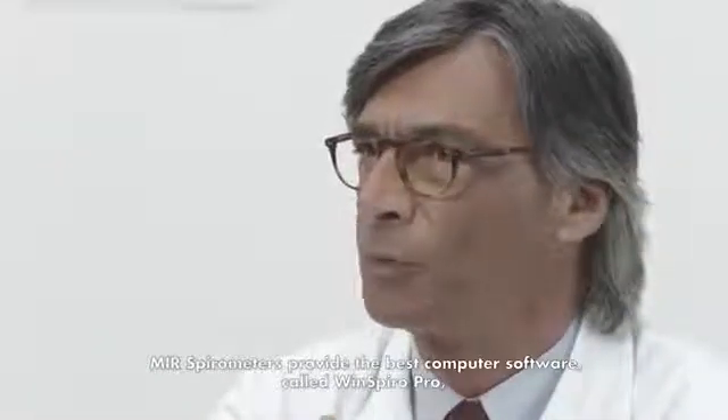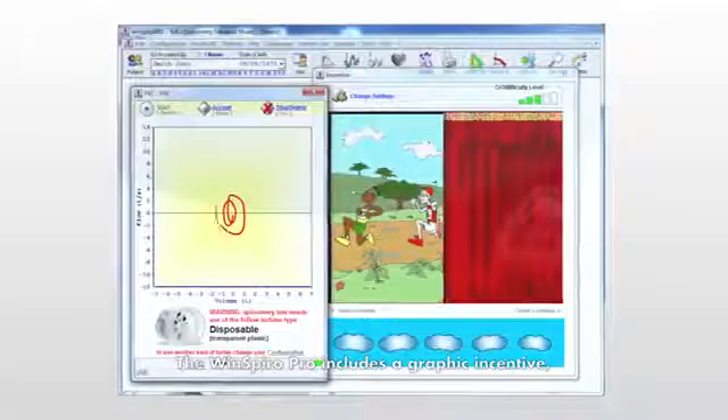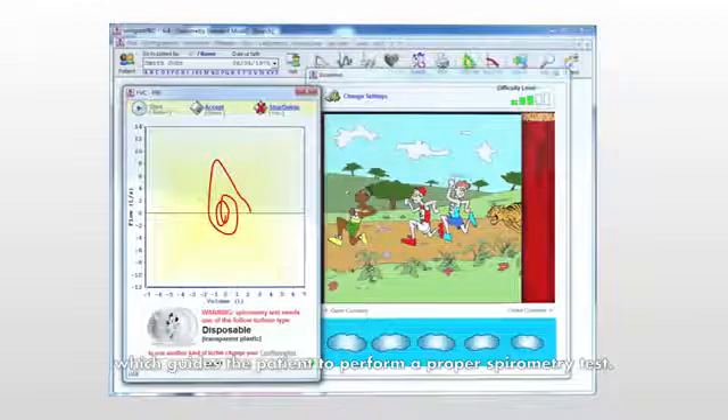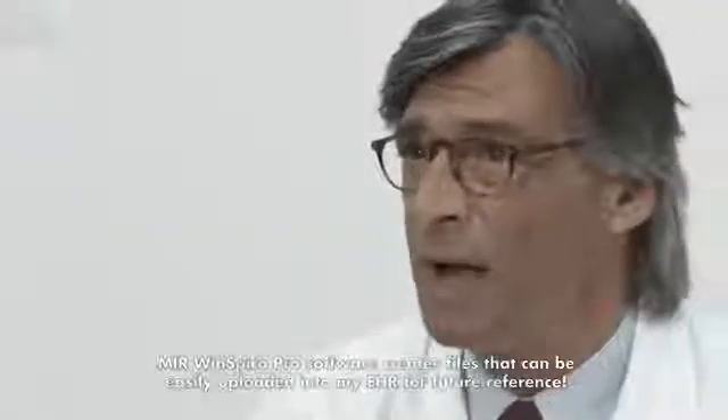MIR spirometers provide the best computer software called WinSpyro Pro to ensure proper spirometry testing and results. WinSpyro Pro includes a graphic incentive which guides the patient to perform a proper spirometry test. I can change the picture or movie based on patient age and appeal. MIR WinSpyro Pro software creates files that can be easily uploaded into my EHR for future reference.